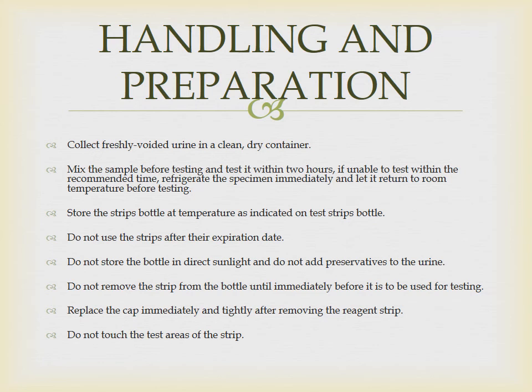Do not remove the strip from the bottle until immediately before it is to be used for testing. Replace the cap immediately and tightly after removing the reagent strip. Do not touch the test areas of the strip.